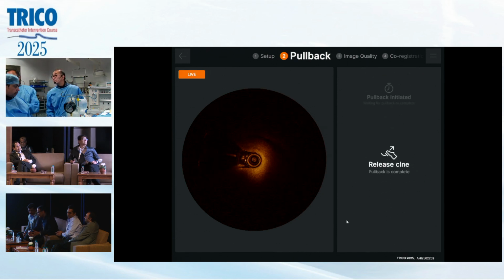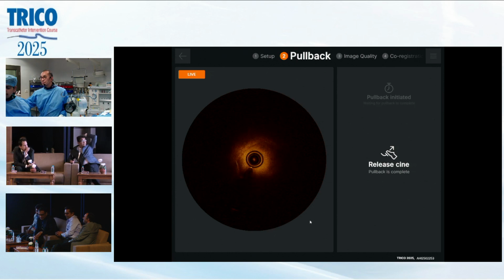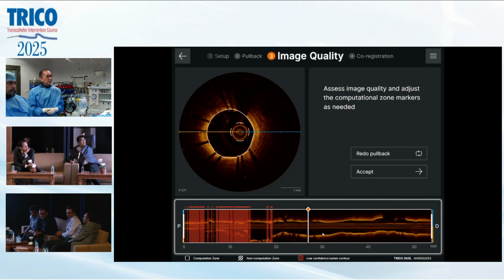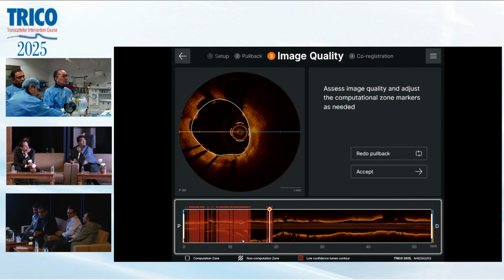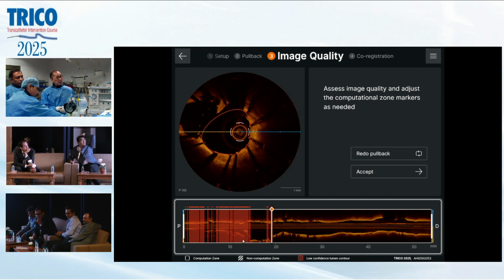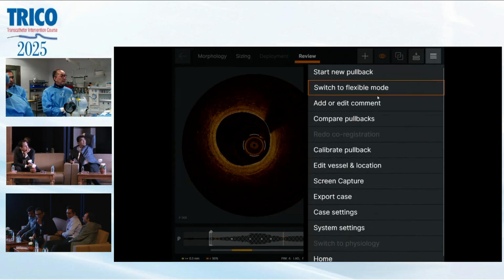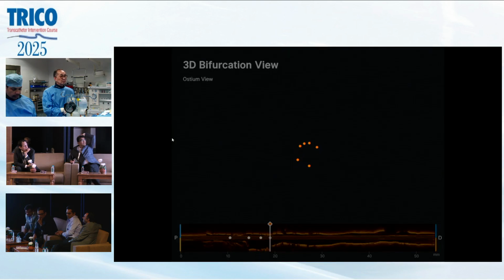During injection, the catheter goes inside. When you inject forward, the catheter moves forward. That's right. Show me the bifurcation. Oh, right here. Okay, here's a bifurcation. We will try to make a 3D reconstruction.